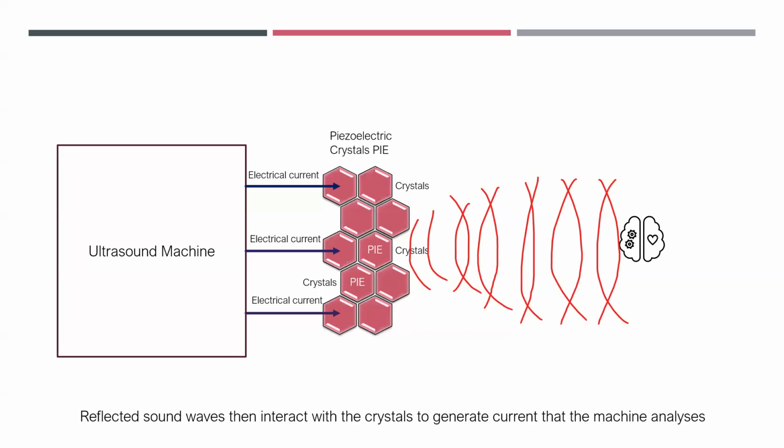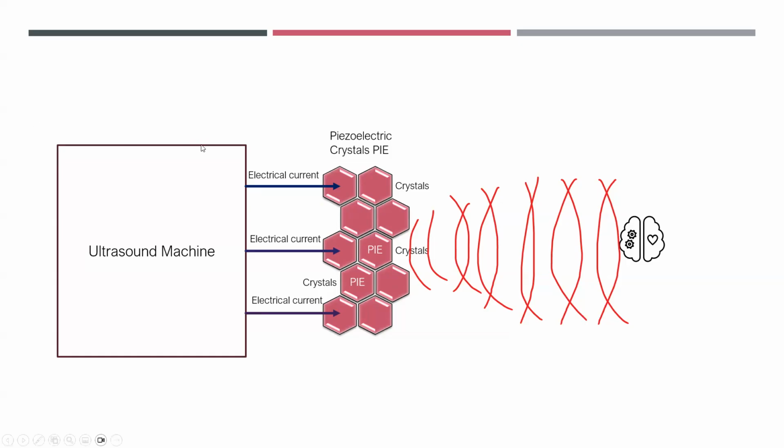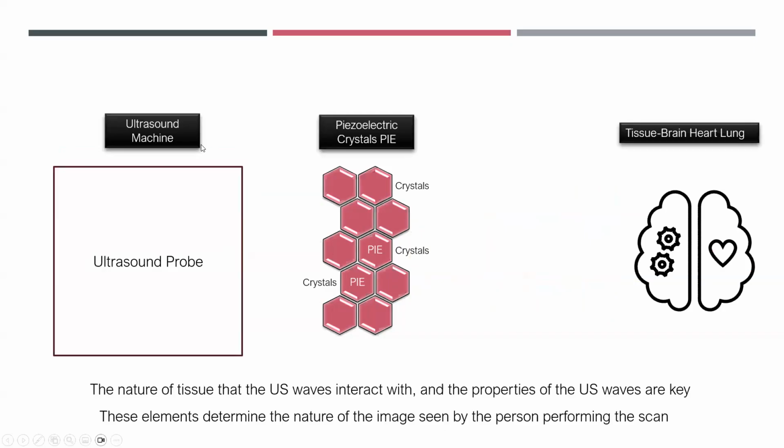What is very important is that depending on the frequency and wavelength of that vibration, you are able to alter and get better quality images if you use ultrasound waves well. It's really important that you get a very good idea of why we use particular frequencies for different issues, because it's not just the frequency of the probe that is important.